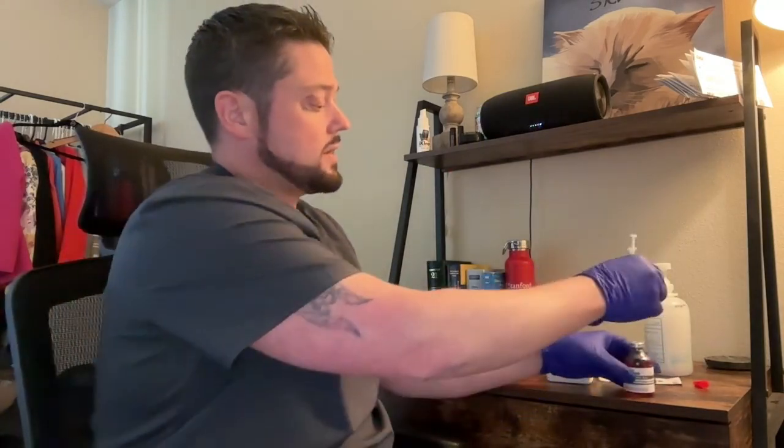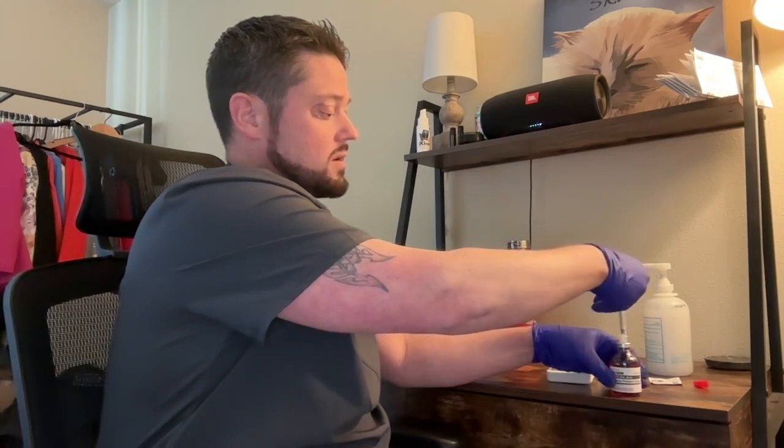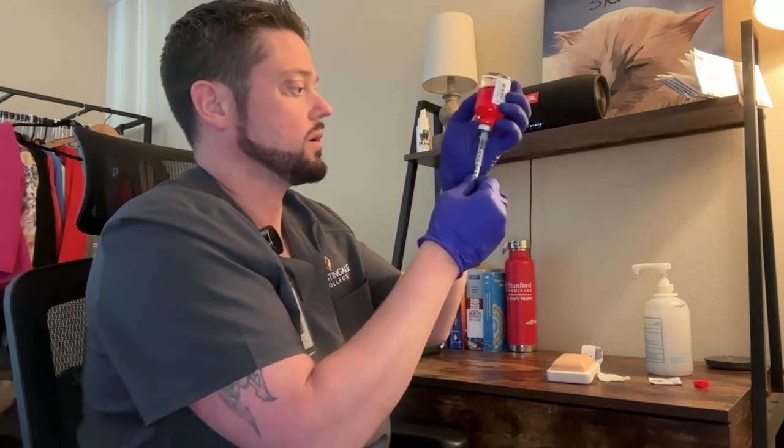And we're going to go ahead and insert the needle into the vial. And we're going to expel the air, the 0.1 ml of air. We're going to go ahead and invert our vial. And we're going to pull back on the plunger until we are at 0.1 ml.